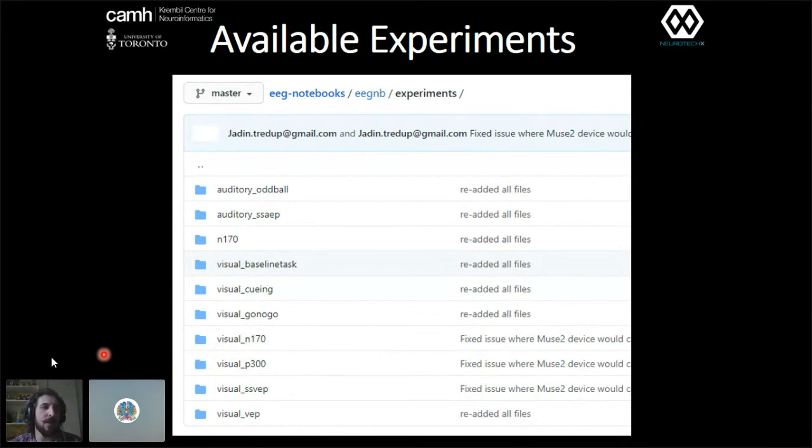And there's not actually much out there that does that, even for straight up visual or sensory PsychoPy-based psychology experiments, not in the way that we're doing it here. There's Pavlovia, which will run in the browser, but it's doing something slightly different. So the library is expanding, and that's great, and we're definitely looking to expand it further.